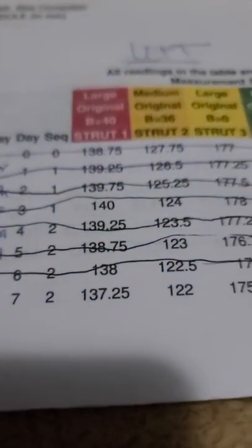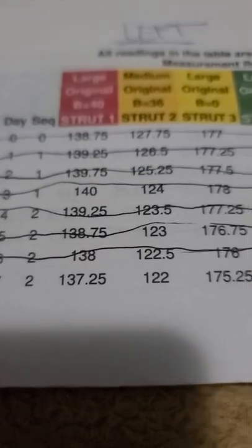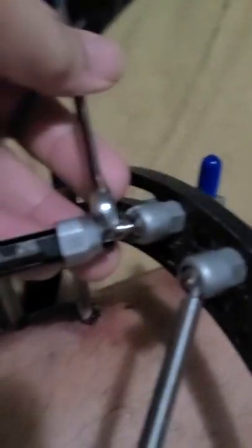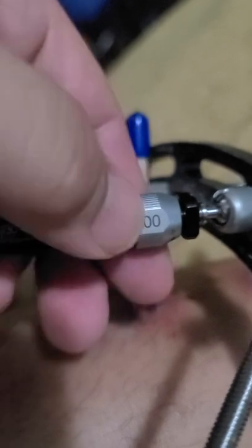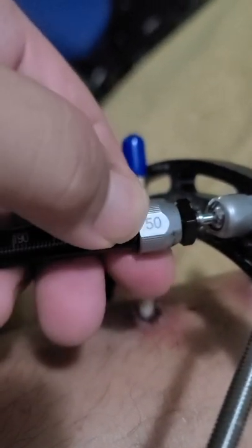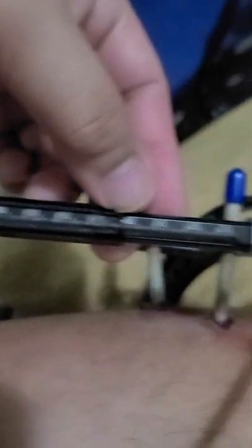Starting with number one — I need to go to 137.25. Yesterday it was 138. I have tools to lock and unlock the struts. I'll unlock this one first. Since we're going down from 138, that's 137.75, 137.5, and then 137.25 — which marks our designated level.